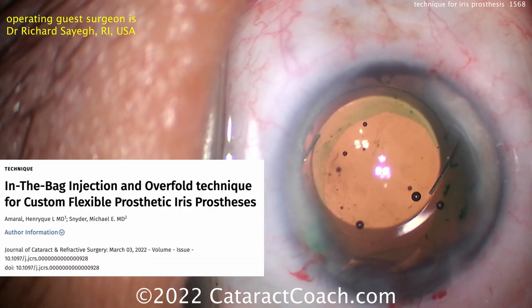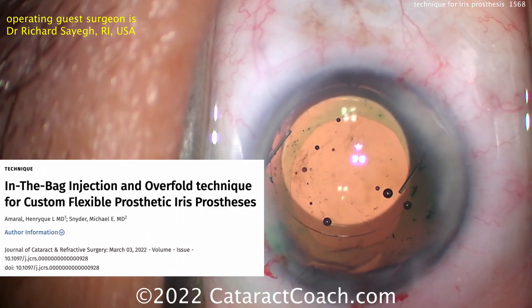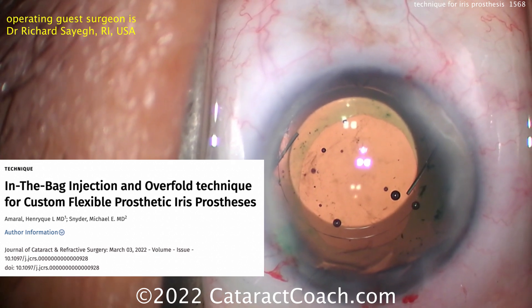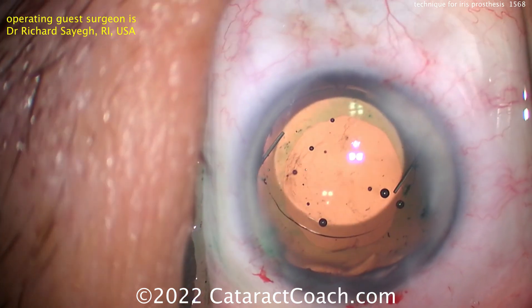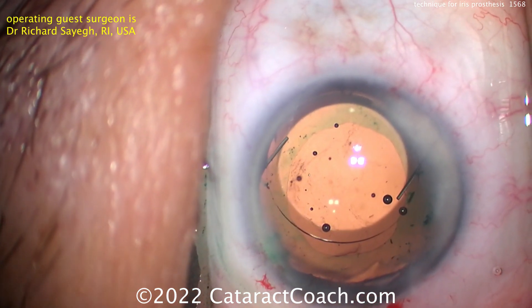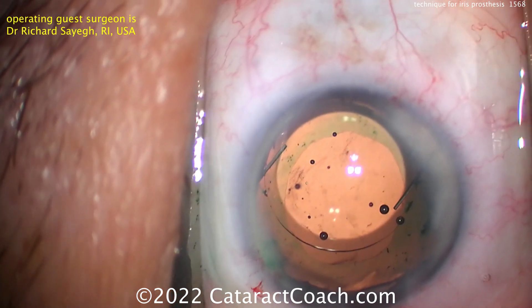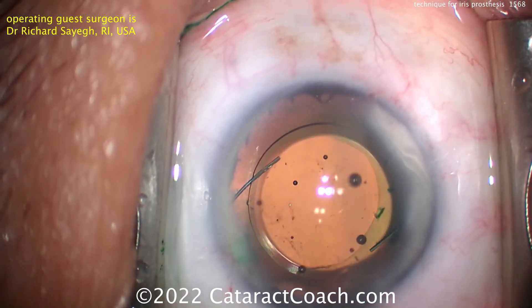There's a paper published by Dr. Henrik Amaral showing the in-the-bag injection overfold technique — how to get this big prosthetic iris into the capsular bag. This video features Dr. Richard Saig from Rhode Island, USA, and we're going to watch his technique. The big challenge here is that the capsular bag is obviously delicate and fragile.